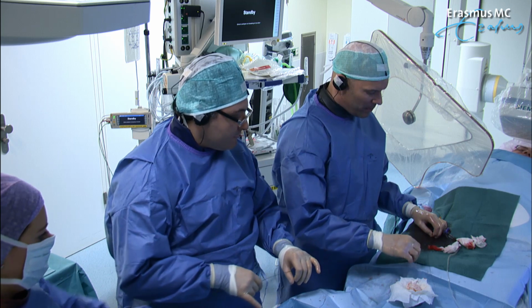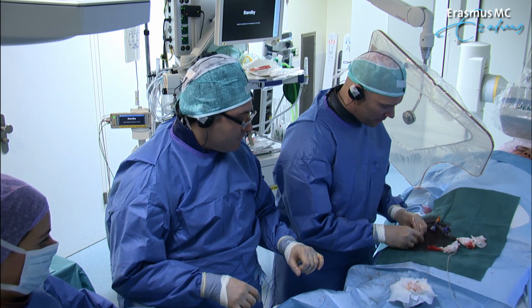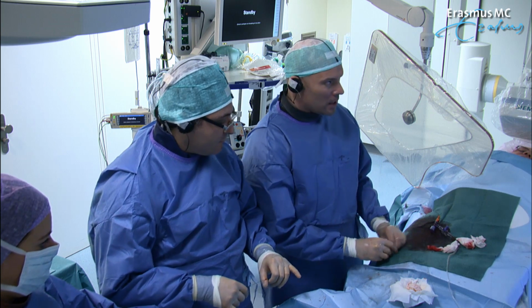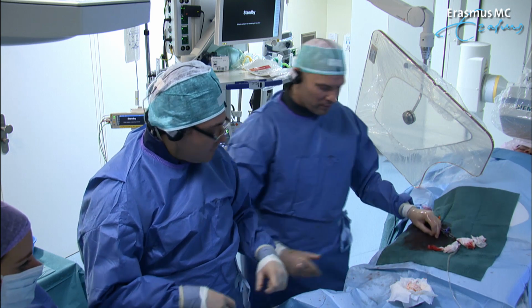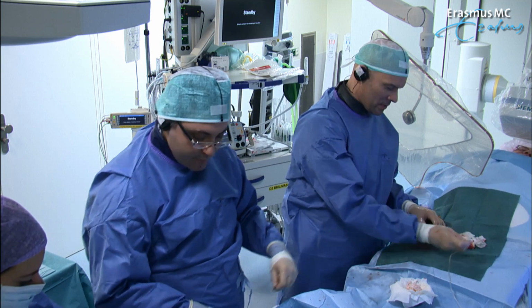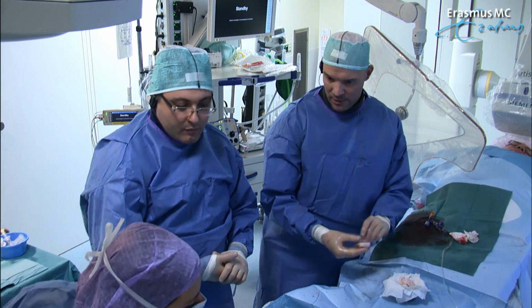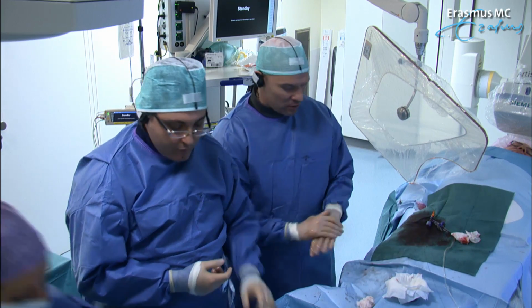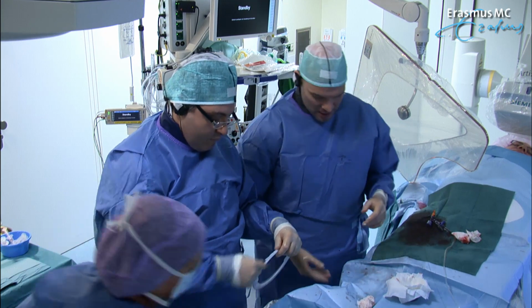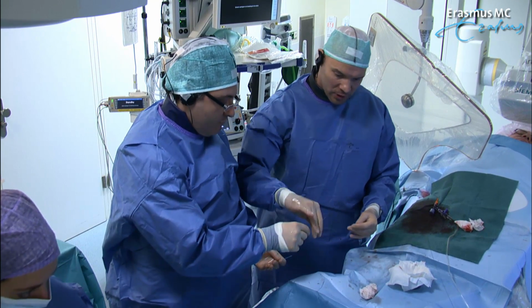We've already prepared the ostium of the circumflex. So maybe let's try and advance a stent into the circumflex. Okay, so let's go with a 3.0 by 8 Synergy stent. A Synergy stent is one of the next generation, or newer generation, drug-eluting stents with an abluminal coating.